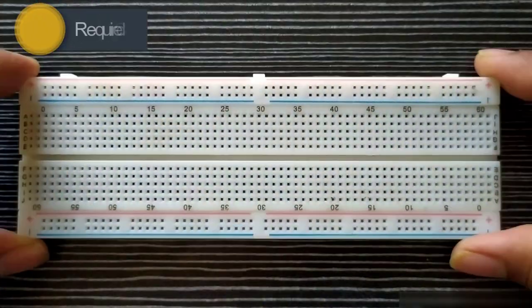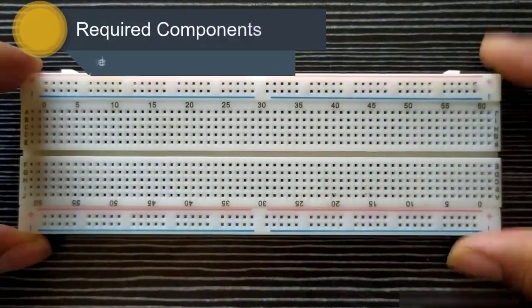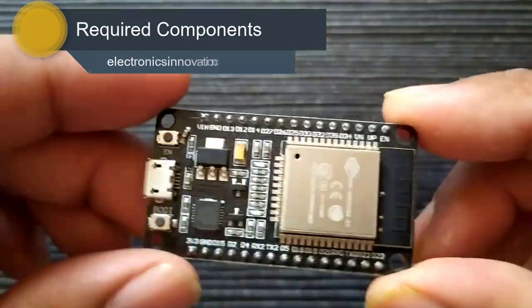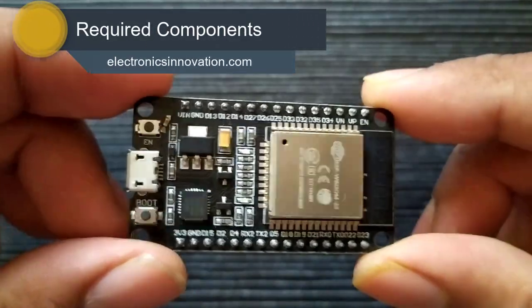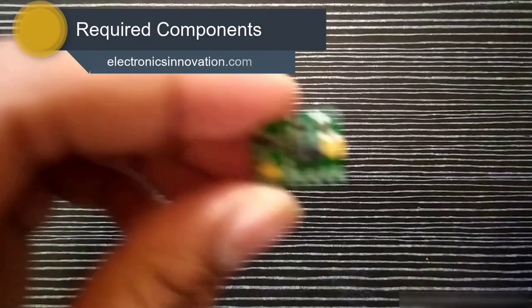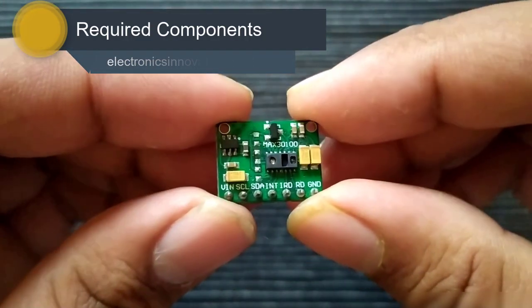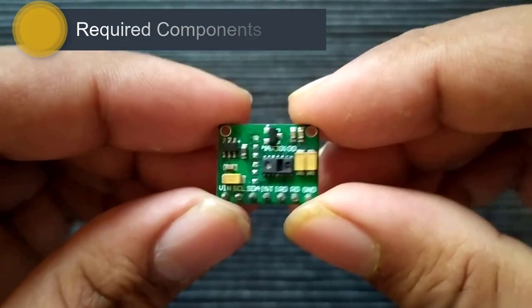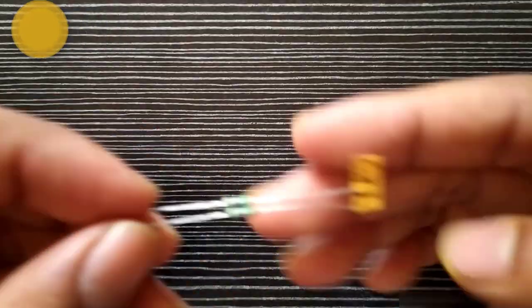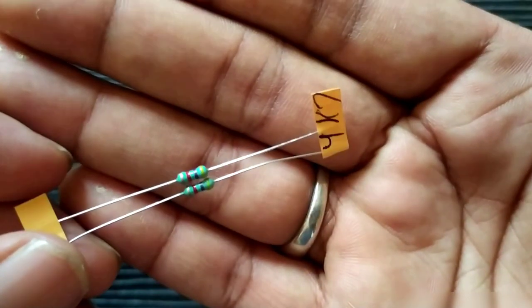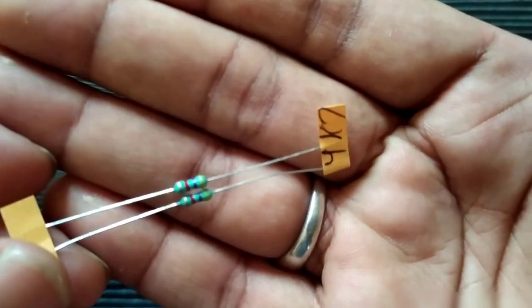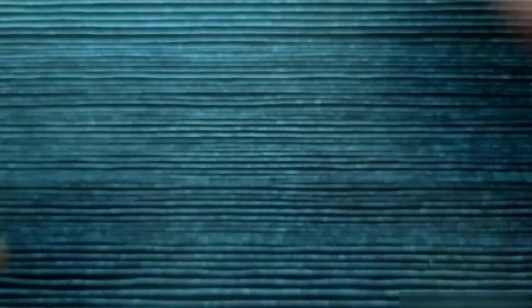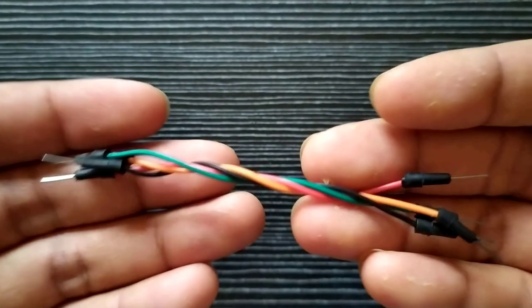The required components are breadboard, ESP32 module, MAX-30100 pulse oximeter sensor, 4.7kΩ resistors, and some connecting wires.